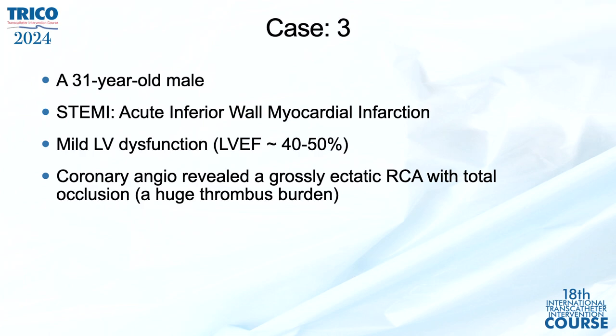I think at the end it looked very good. And how do you size around the aneurysm? That's a good question. I just dilated and stented looking at the left main.